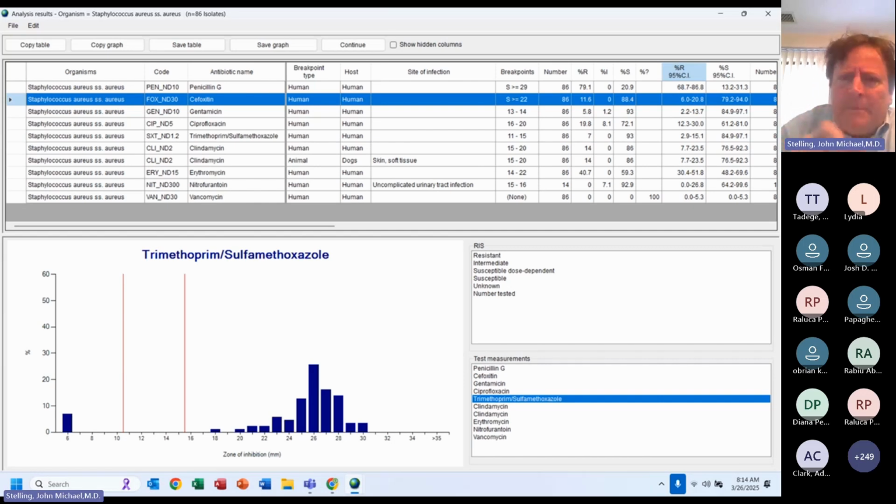There are bacteria that are a little bit resistant that we still call clinically susceptible, but they are microbiologically resistant. We ascertain that with what we used to call the microbiological breakpoint. Now they call it the epidemiological breakpoint or the epidemiological cutoff value. So the goal of those breakpoints is to find resistance genes from a phenotypic perspective. What is the best way to find resistance genes? Use sequencing, of course. But if you don't have sequencing, the ECOFF can help you say, these bacteria look like they might have a resistance gene, and therefore I'd like to do some molecular typing.